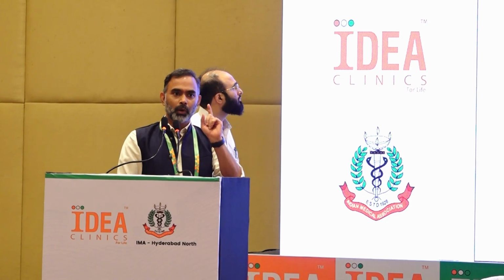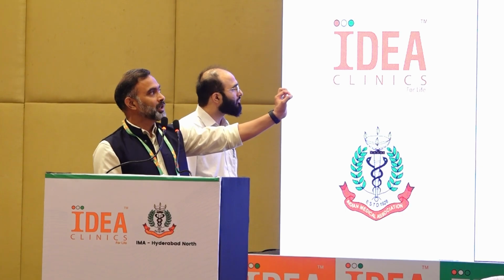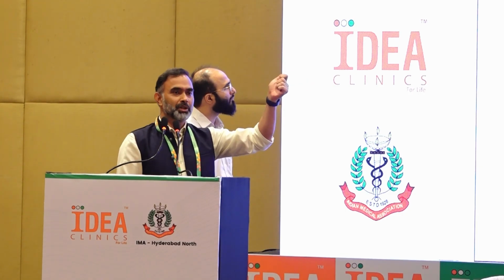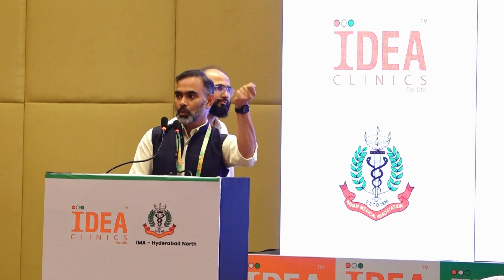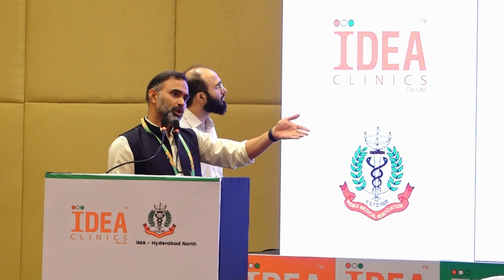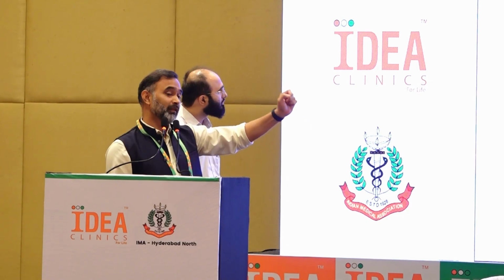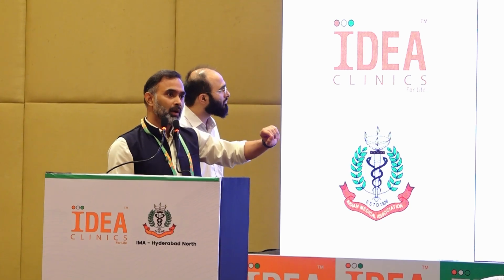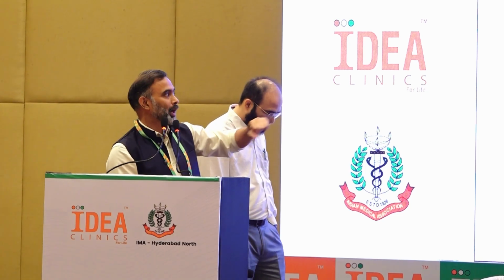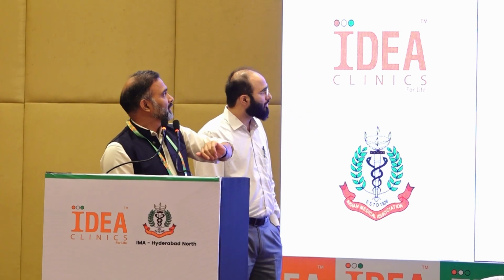As a doctor, I only need to put settings once before I start the pump, which is the insulin to carb ratio and the glucose target. Glucose target is basically like temperature. If I want the AC temperature to be 22, the AC will work very fast. If I want it a little slower, if I'm happy, I'll put it on 24. Like that, if you want very tight control, you can put 100, or you can put 110 or 120. Some people who are prone to hypoglycemias, we put 120. Active insulin time, I'll not cover that for now.